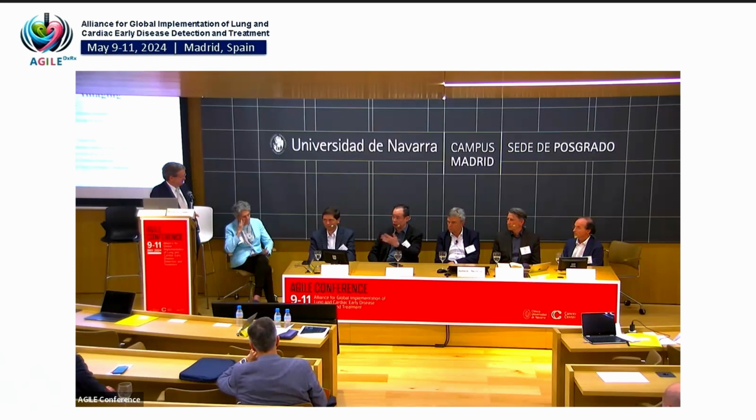They're often injected into your dictation system. And presumably, when you use this software, you're not going to retest it. In other words, if it tells you the score is 500, you're going to assume it's right. You're not going to measure it yourself, because what's the point? If you measure it yourself and realize, oh, it's really 400, not 500, why would you remeasure it if the software already did it for you?